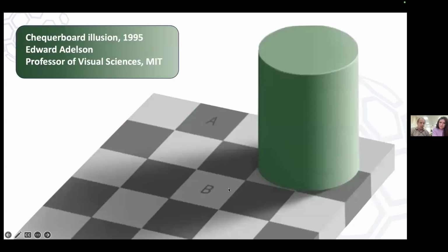The reason we stopped relying heavily on times 40 is because we realized that our brain translates the input. The eye gives the input, but the brain modifies it in many ways. I just want to show you this checkerboard illusion to make you aware that our brain fools us. It's a famous illusion.